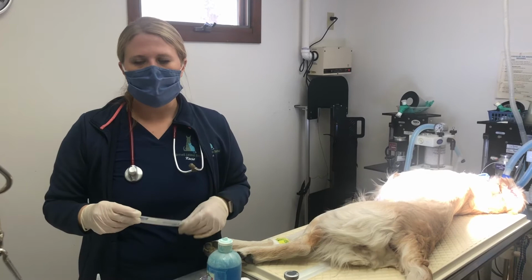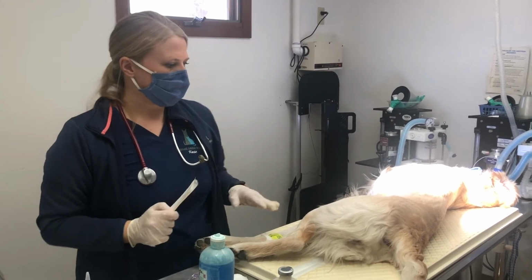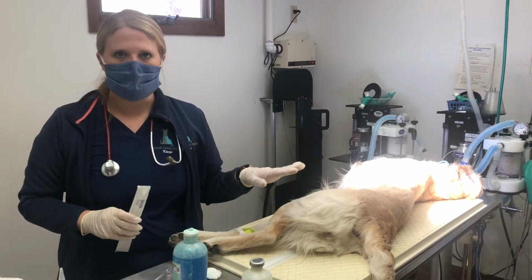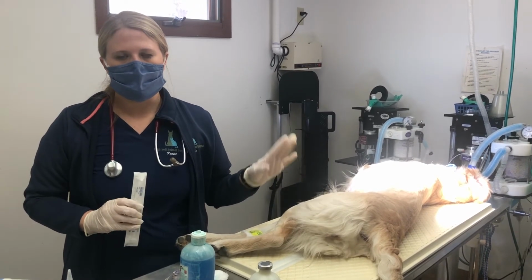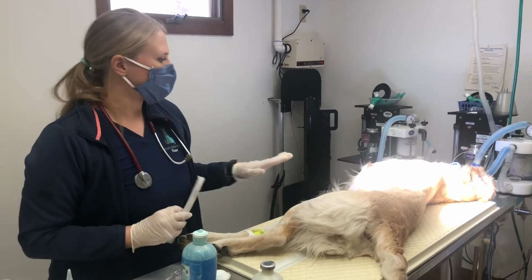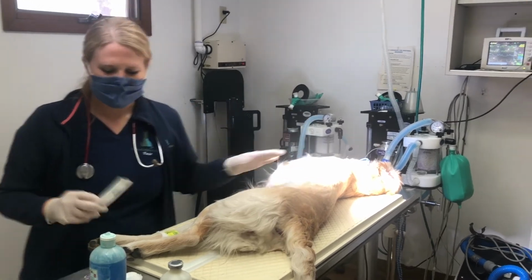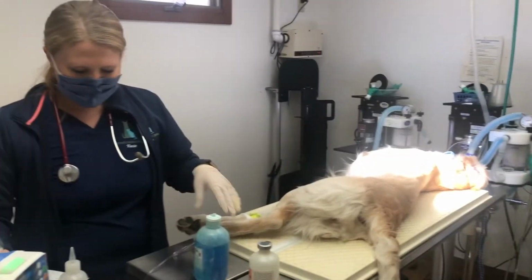In this video we will be demonstrating how to get a vaginal cytology sample. We test the epithelial cells, looking to discover what stage of the estrus cycle the female would be in. We do have an anesthetized patient who is hooked up to our monitors who just had surgery, and we're going to collect the sample today.